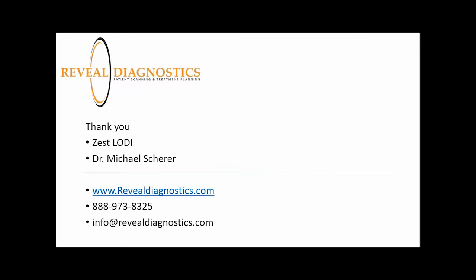As you're first getting started out, feel free to use Reveal Diagnostics as a tool to learn the process. We partner with Anatomage and can offer help and treatment planning with your surgical guides, and so we'll help facilitate that process to help you get started with your guided surgery.